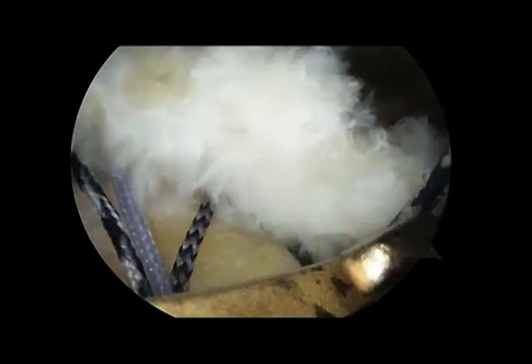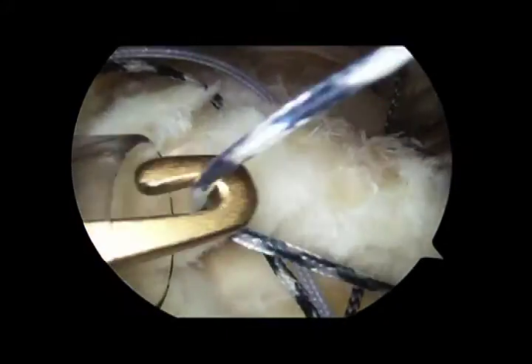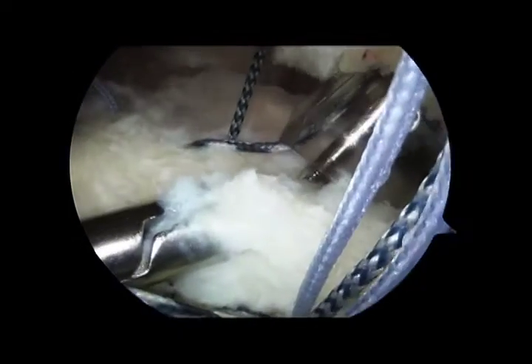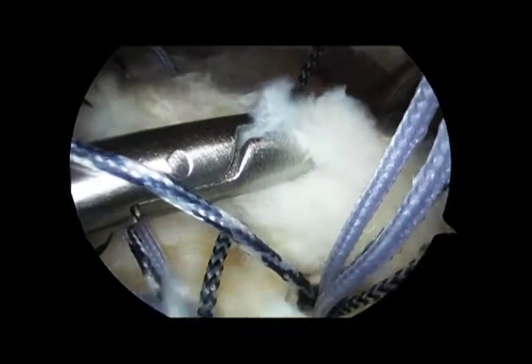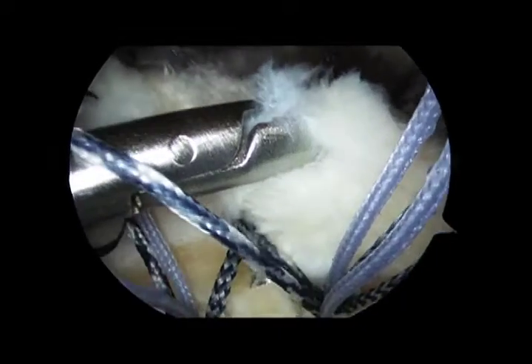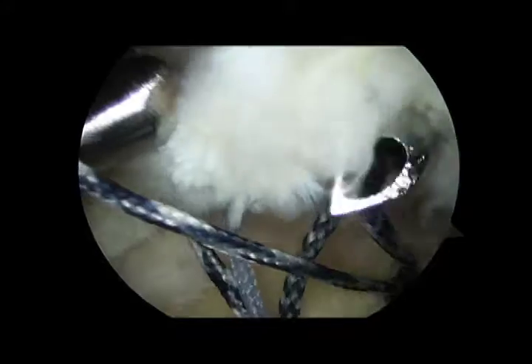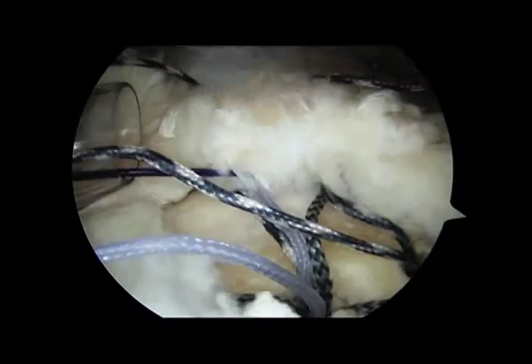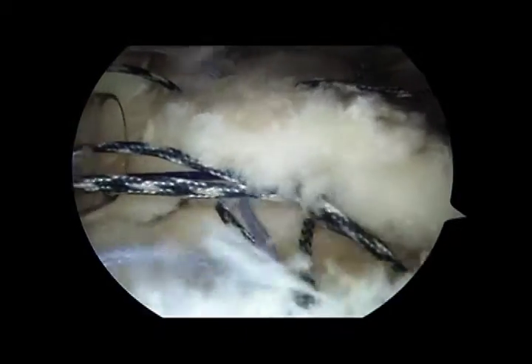The partner limb of the posterior suture is then retrieved at the posterior cannula. A crescent-shaped suture shuttling device is used to pierce the cuff anterior and slightly lateral to the anterior suture from the posterior anchor. A PDS suture is sent in, retrieved at the posterior cannula, and used to shuttle the suture back through and out the anterior cannula.